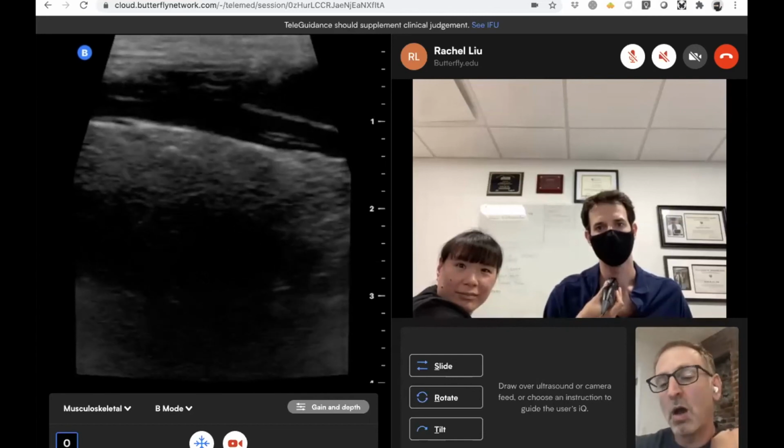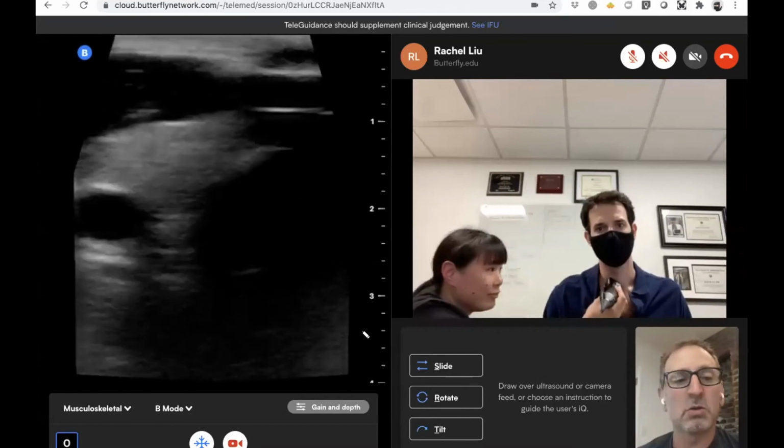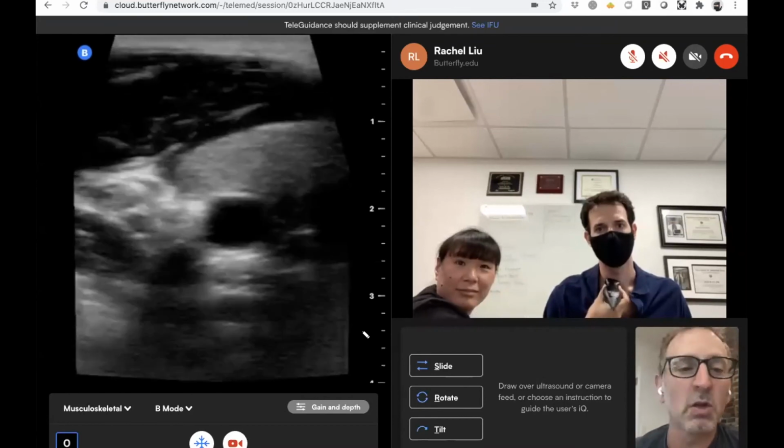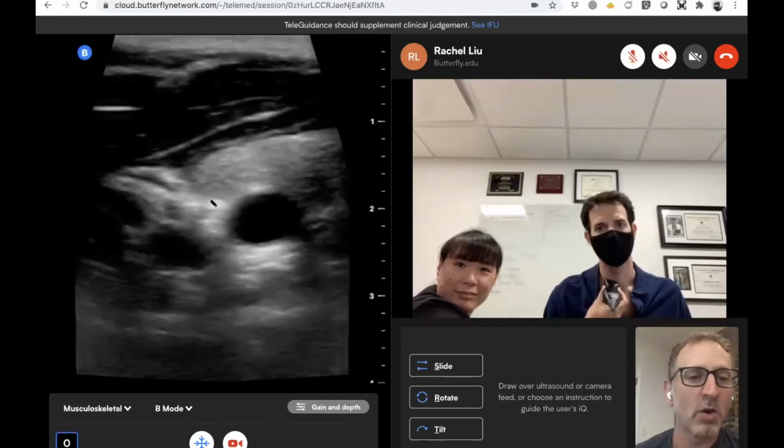You can do measurements. You can go ahead and put color flow on if you were to see a nodule and wonder if it was vascular or avascular. But that's one of the things people wanted to see.